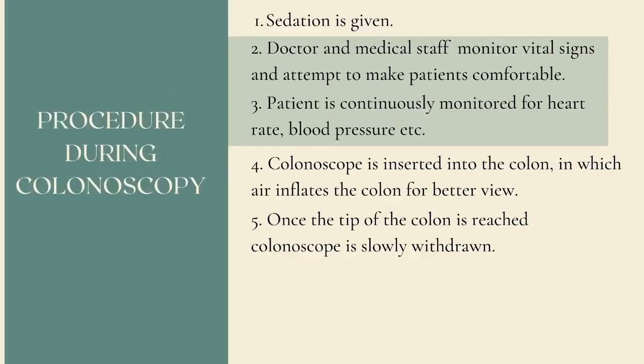Procedure during colonoscopy. Colonoscopy is a safe procedure with low complications. The most significant risk is that it may perforate the bowel. During a colonoscopy procedure, you will wear a gown. Sedation is usually recommended. Sometimes mild sedation is given in pill form. In other cases, a sedative is combined with intravenous pain medication to minimize any discomfort. It helps the patient to be relaxed.